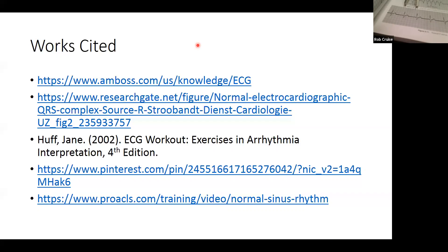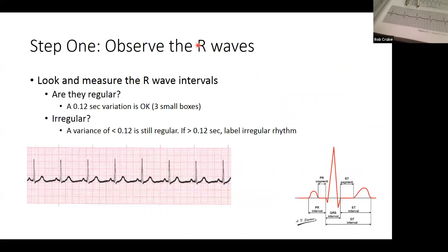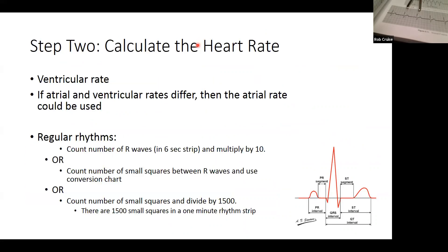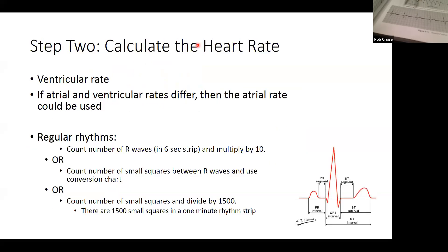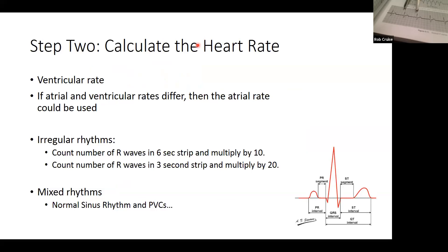Now let's look at the rhythm rate on this real strip. Counting the large boxes between the R waves: one, two, three, four, five — five large boxes. So this is a rhythm of 60 beats per minute. That puts it in normal sinus rhythm territory. So we can say: regular rhythm, rate of 60.